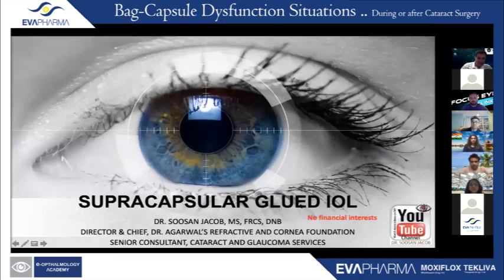Okay. So my talk is on supracapsular glued intraocular lens. And I must say at the outset that I do not have any financial interest in this topic. This is a technique that I described in about 2013, and I will show you why it is so beneficial and something that everyone can possibly include in their surgical armamentarium.